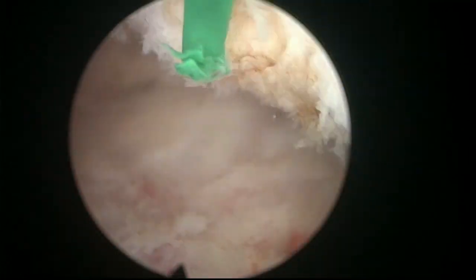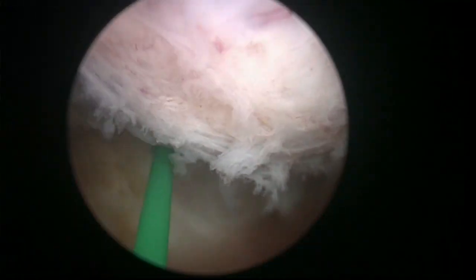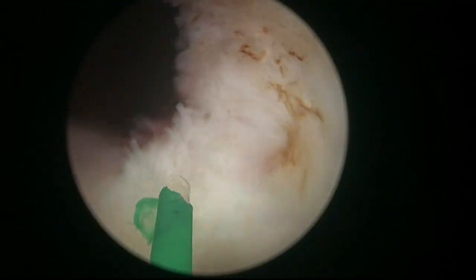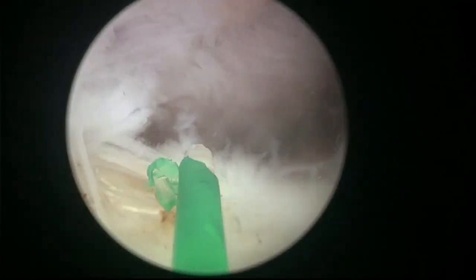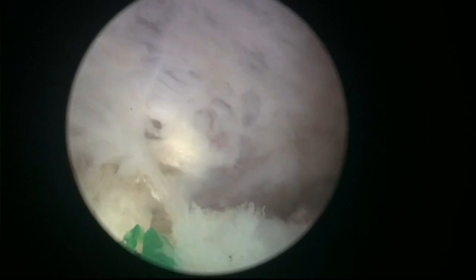And you see now we managed to push one lobe into the bladder and now the other lobe. So the prostate has flipped completely. You can see that it has flipped. It's quite big, but here we have the bladder neck attachment that we're going to, and notice that I have placed my fiber at 6 o'clock. Then, muy bien. Bueno, muy bien. Now it's completely free, huh?